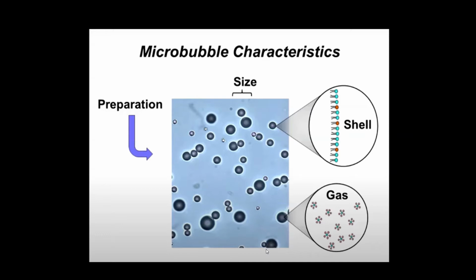This is very different from a microbubble. I always think about a microbubble as one of those exercise balls that maybe some of you sit on when you're working at your desk. The shell is actually pretty bouncy and very sturdy. The shell is actually a phospholipid shell like you would see in a micelle or something like that, and inside the gas is a PFC gas. It's not atmospheric, so the shell is stable, the gas stays inside.